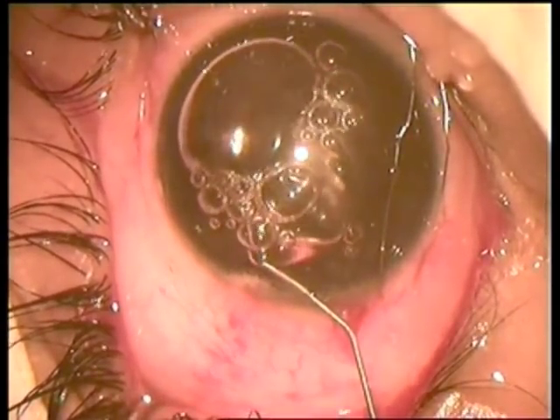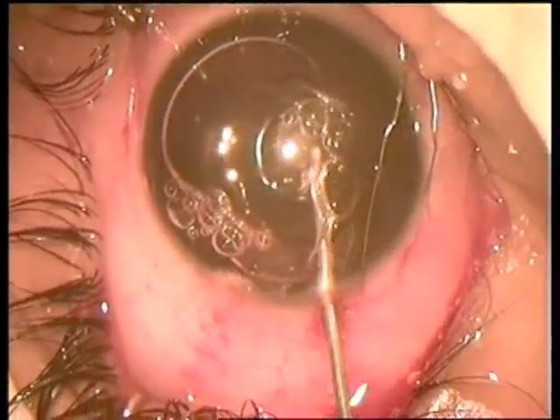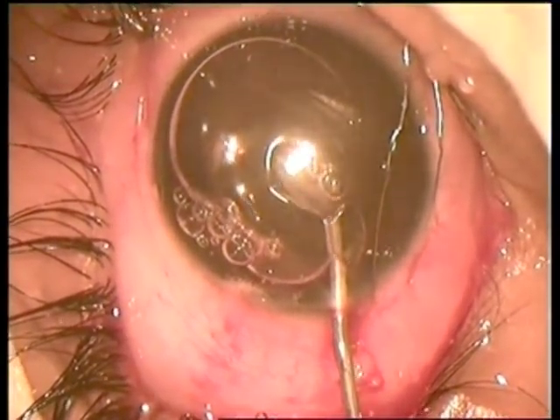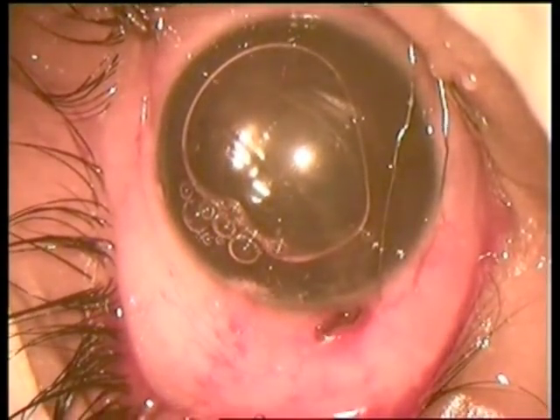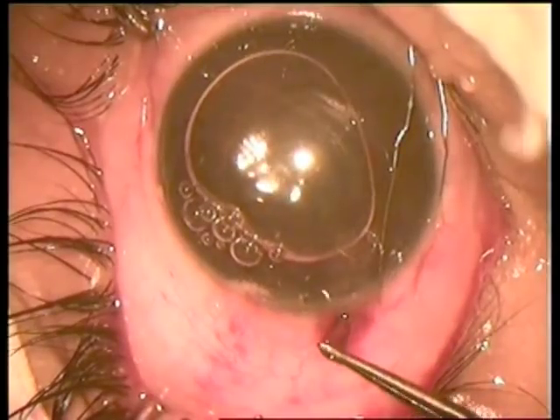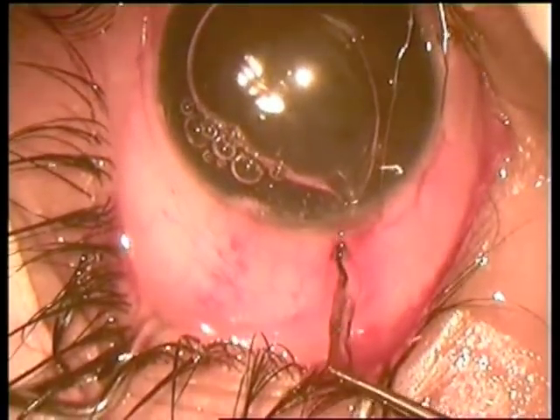Air is injected and it goes far, deepening the anterior chamber. The capsular bag is aspirated again with the same 22-gauge cannula, and the capsule is pulled out.